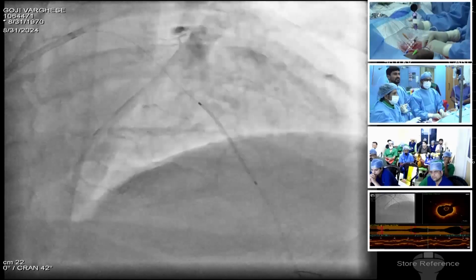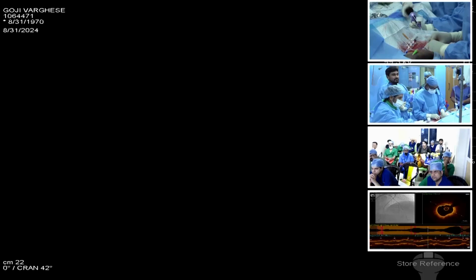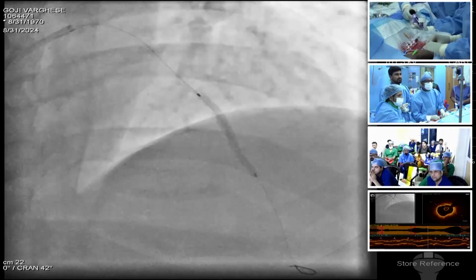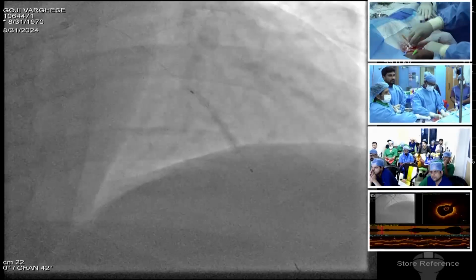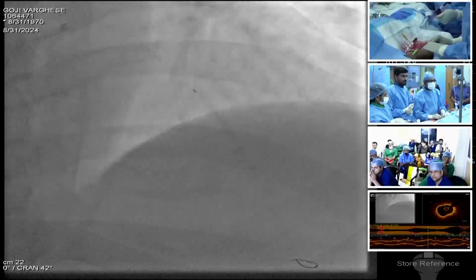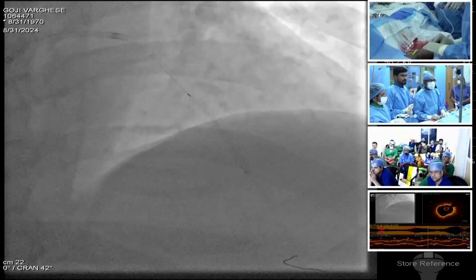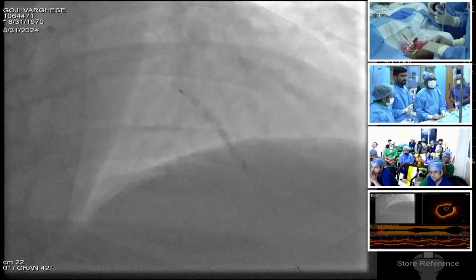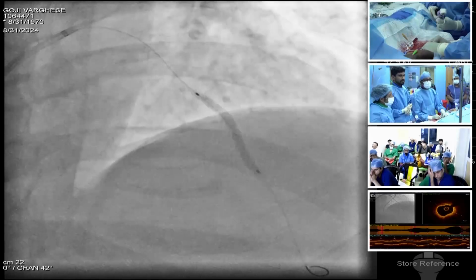Yes, I think we'll go up there. 12, 14, 12. Enough. Negative. Okay, 16 and 18. Negative.